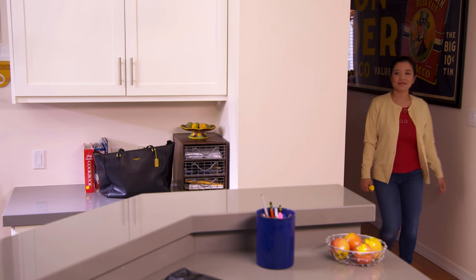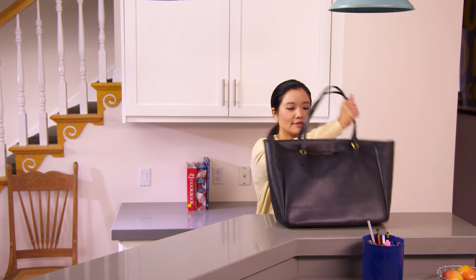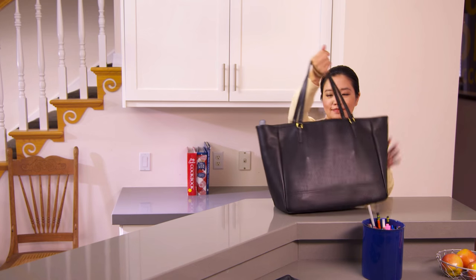An auto-injector can be stored almost anywhere that's room temperature. It shouldn't be kept in the refrigerator or in a particularly hot place like a car. And it should always be stored in its case to protect it from sunlight and any possible damage.